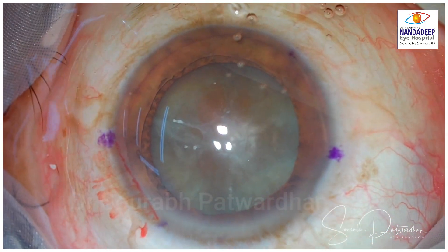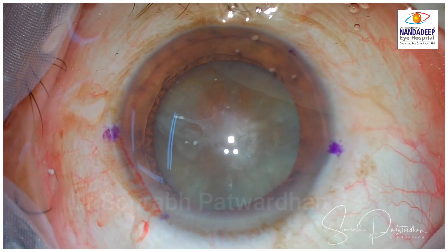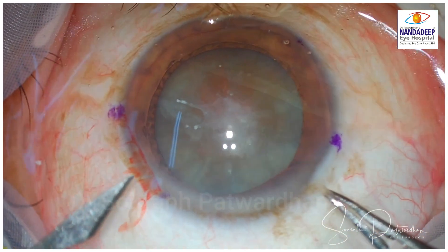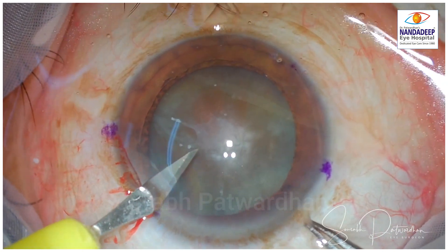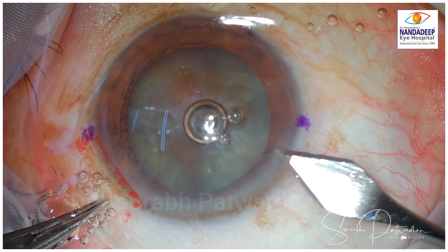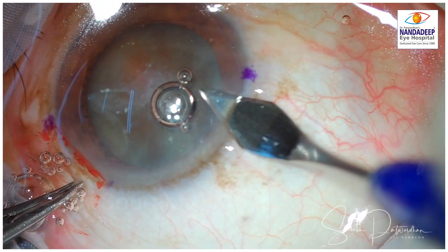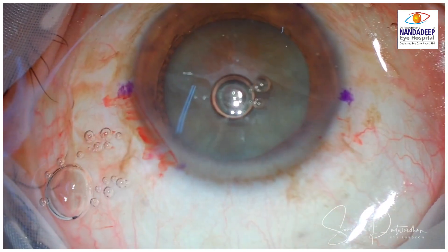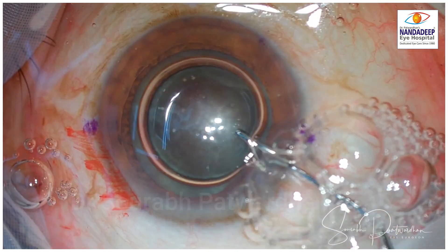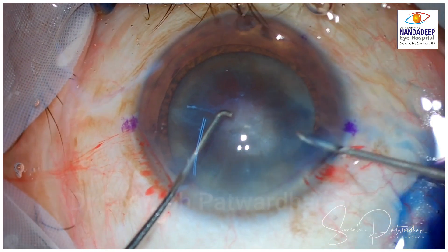A few surgeons prefer to do it more clear corneal than limbal to have a better effect. For any further incisions, I try to avoid the area where I have done the LRI. There is also the option of making the main incision through the LRI, but I find it a little unstable, so I always try to avoid the area of LRI when making the incision.